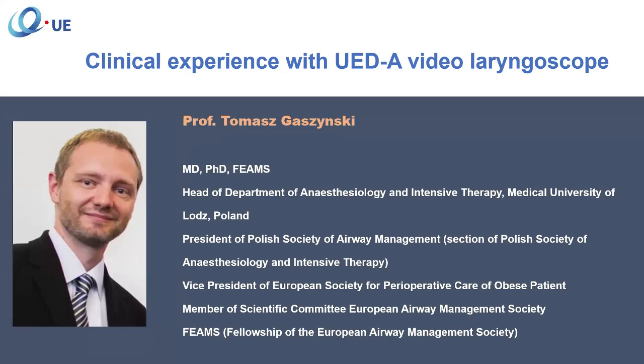So now I would like to invite you to my speech about clinical experience with the UED-A video laryngoscope.